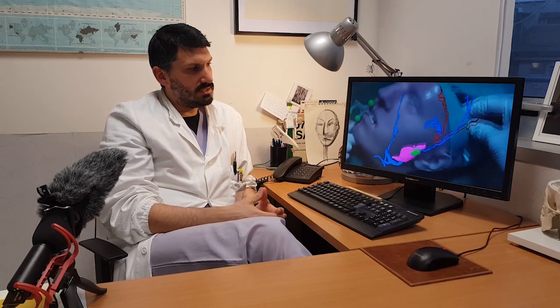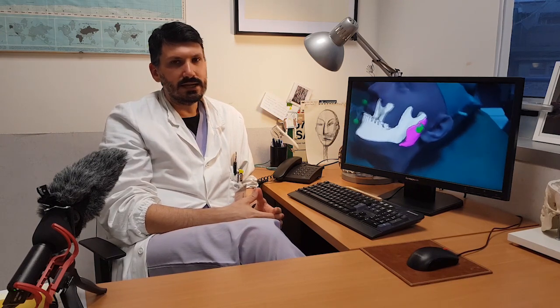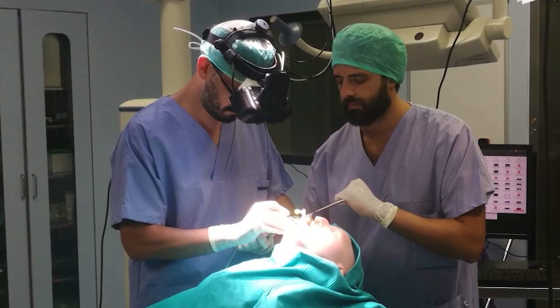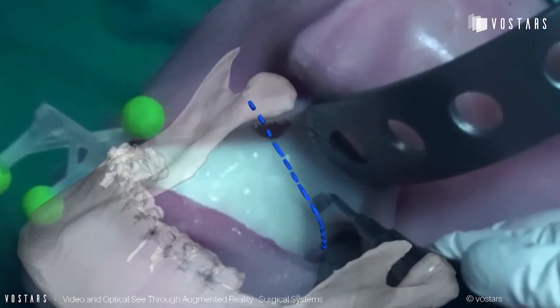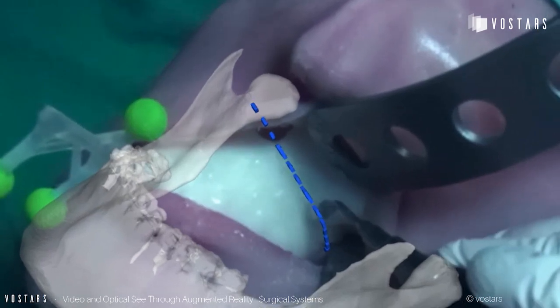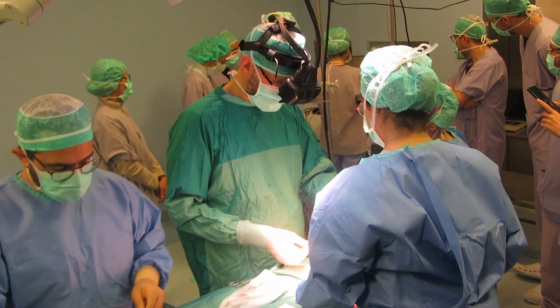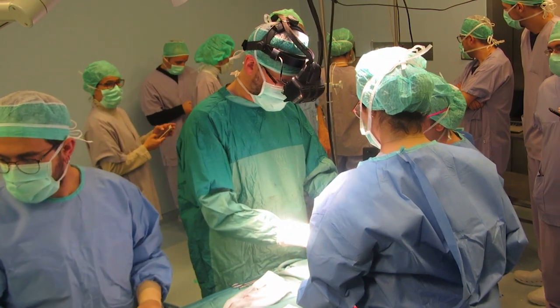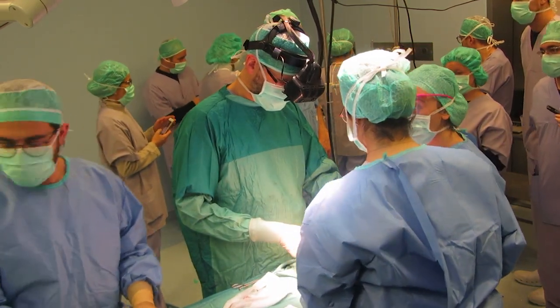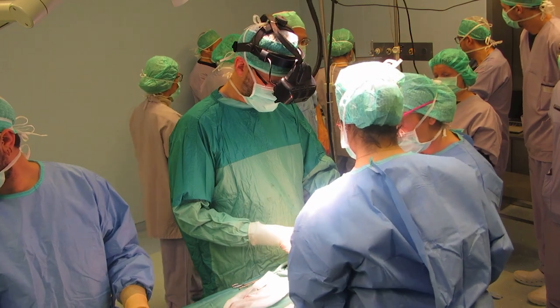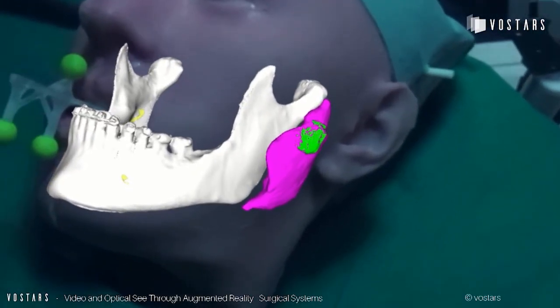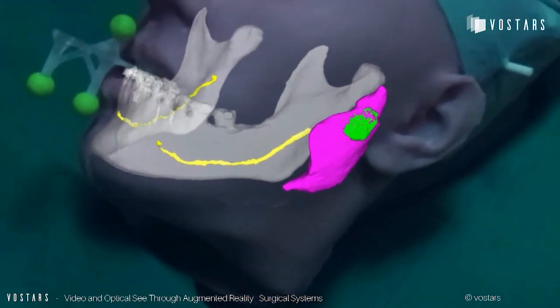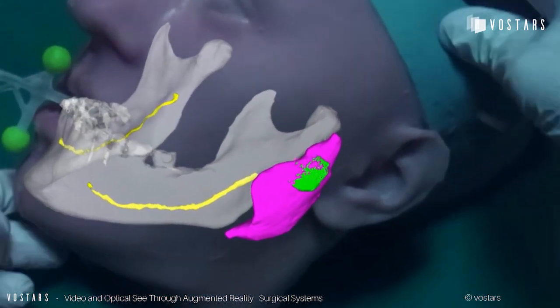This is the experimental environment in which we tested the device at the beginning, before moving on to the experiment on human beings. And to make the experiment as accurate and realistic as possible, this was conducted on reproductions of real patients, like this one.